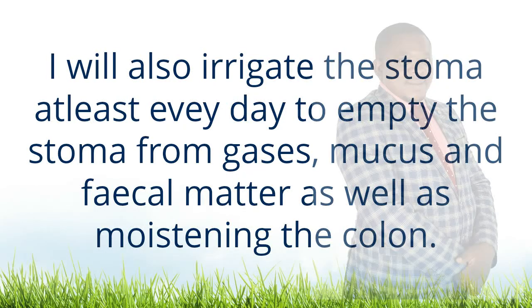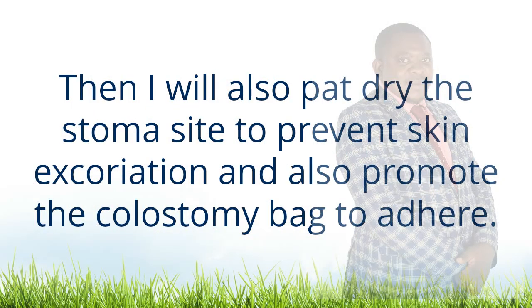Stoma irrigation: I will also irrigate the stoma at least every day to empty the stoma of gases, mucus and fecal matter, as well as moistening the colon. Then I will also pat dry the stoma site to prevent skin excoriation and also promote the colostomy bag to adhere.